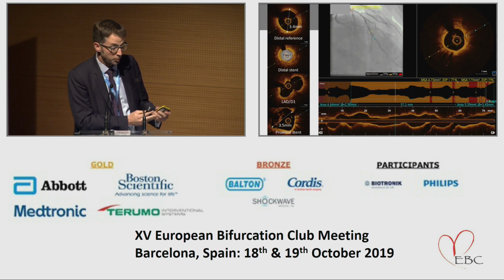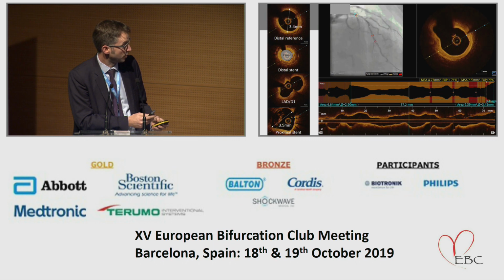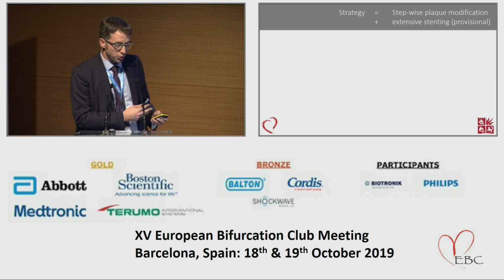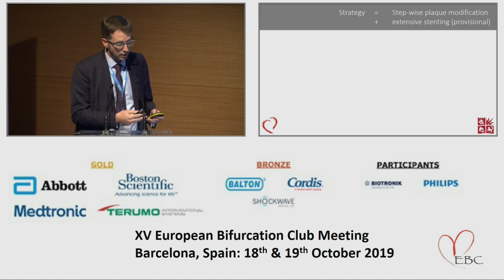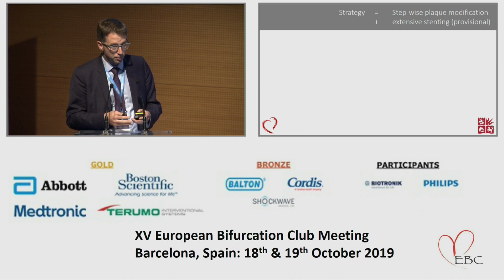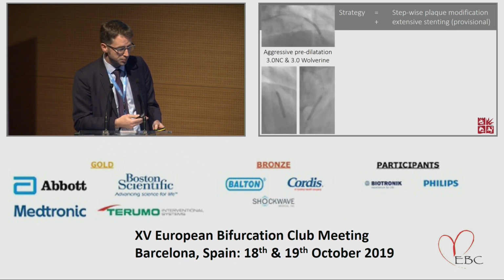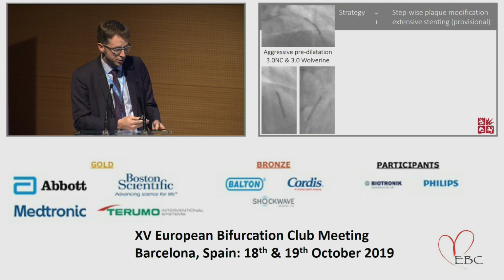I don't know whether we want to comment, or I can just show you what we did. It's probably most instructive. There was some discussion earlier about what we do about calcification, and imaging with now multiple modalities for modification has led to quite an interesting idea of developing algorithms. In the first instance, I think ballooning and trying to modify the calcium is very reasonable. So we took a fairly aggressive approach with a 3.0 non-compliant and then a 3.0 cutting balloon to high pressure.